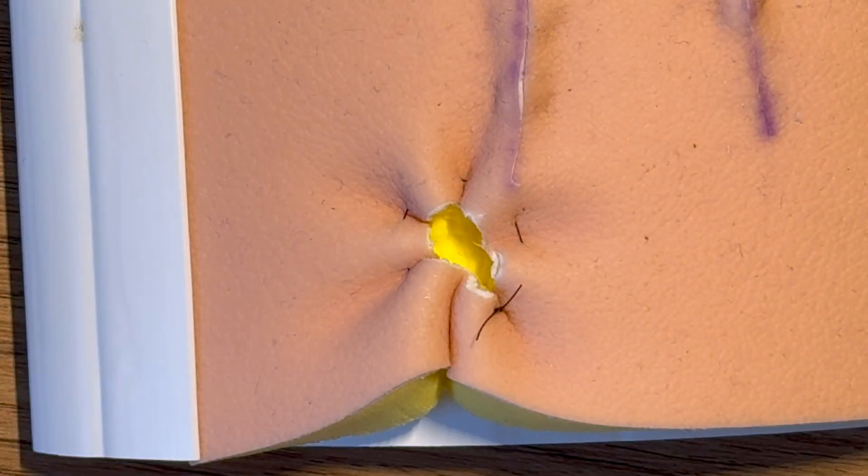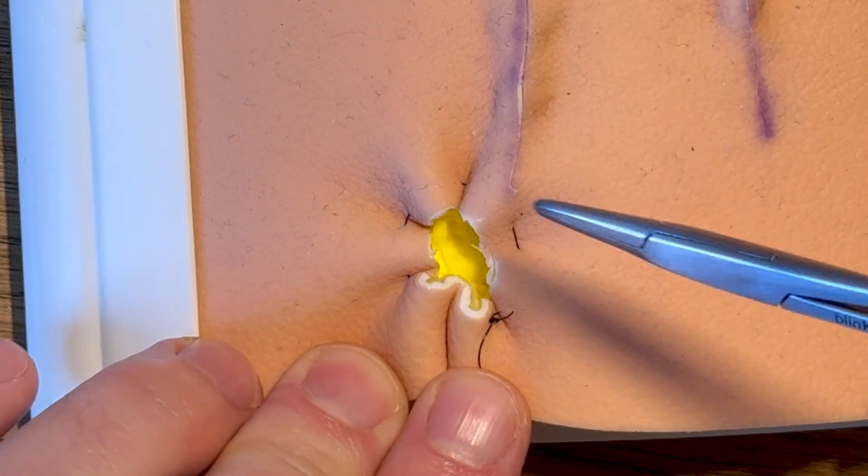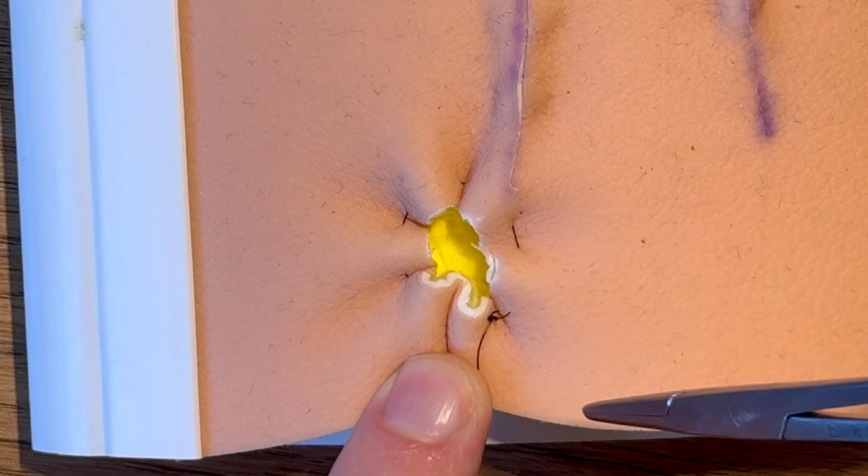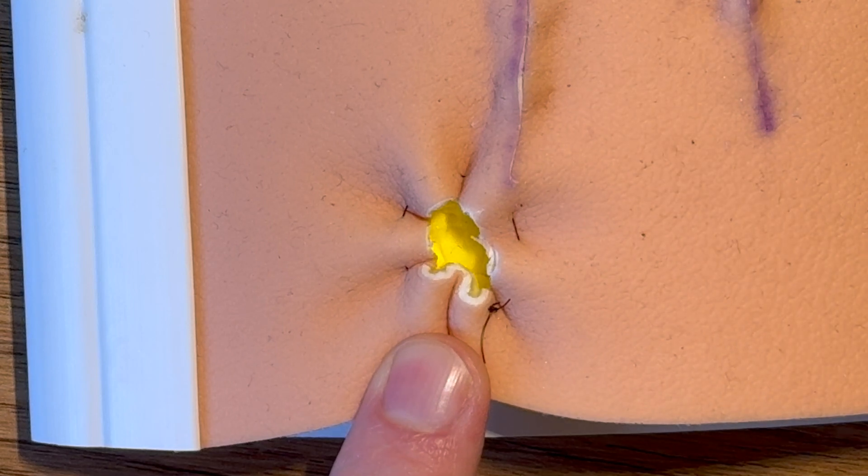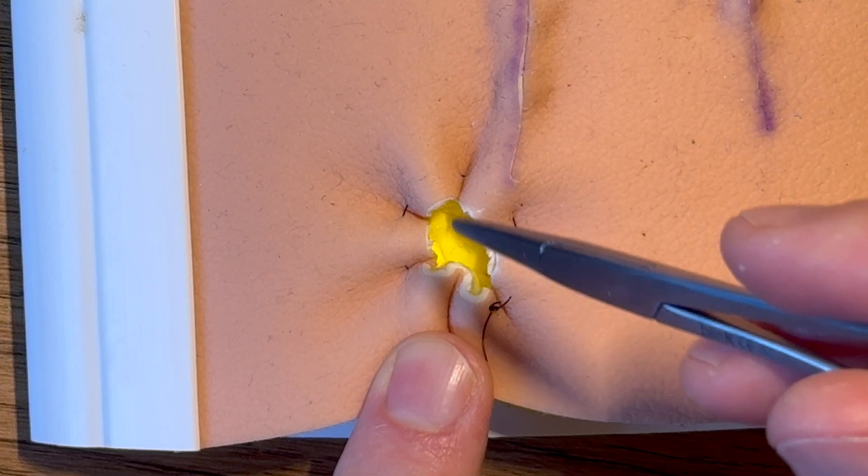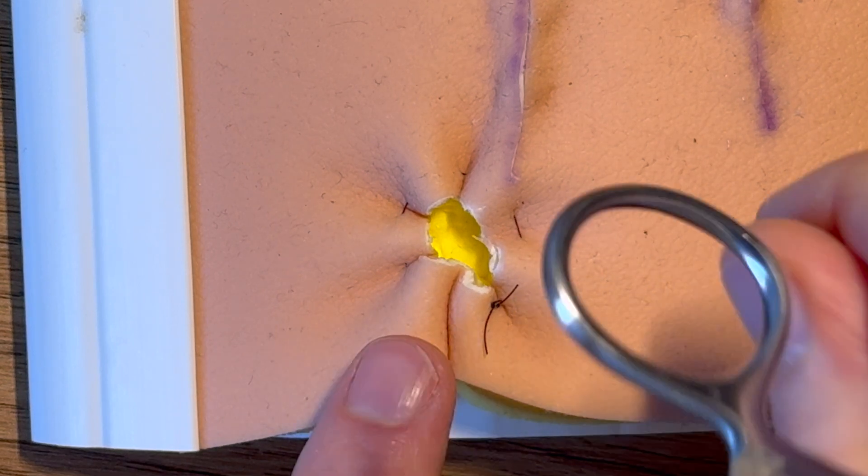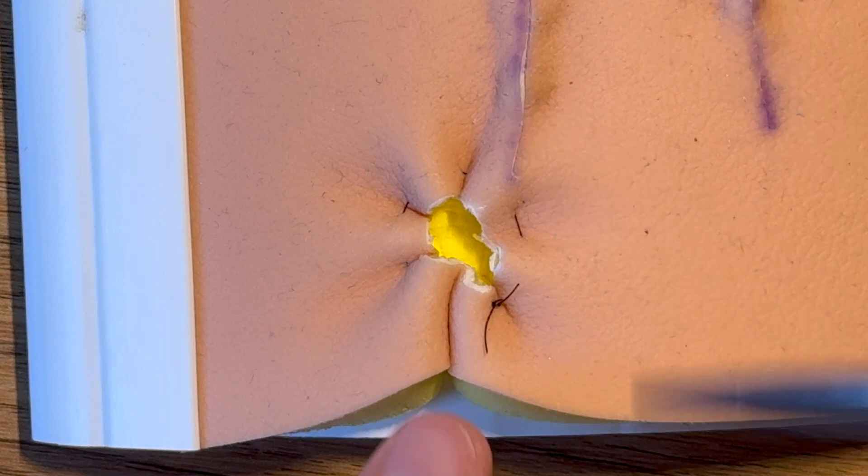So then you're just going to dress that in the same way as I mentioned for the other technique. And you're going to be able to take that out after 10 to 14 days probably because you've got nothing else holding the wound together, but the healing should be well underway by that stage so that's going to speed things up.